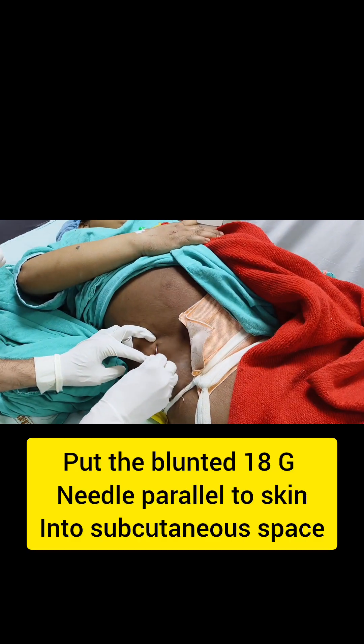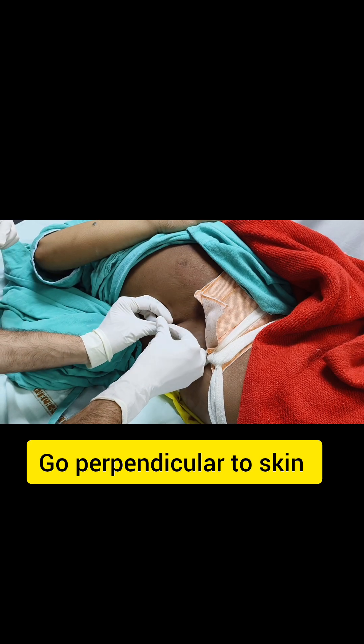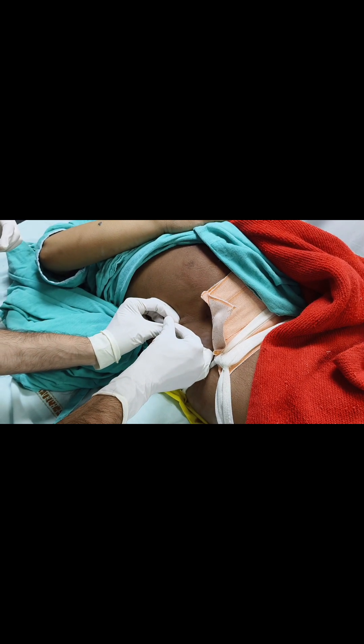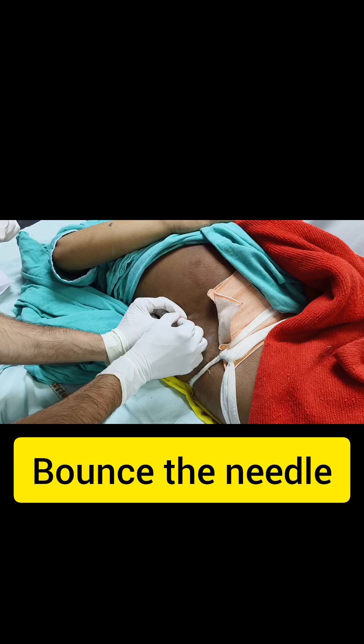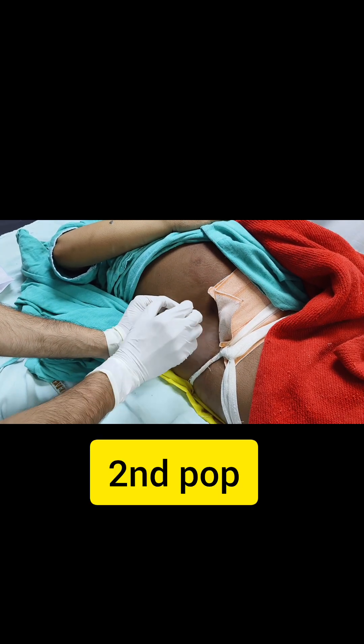Once you are into the subcutaneous space, then go perpendicular. Feel for the bounce. Go inside. This is the first floor. Now you will again bounce the needle and try to feel another. This is the second.